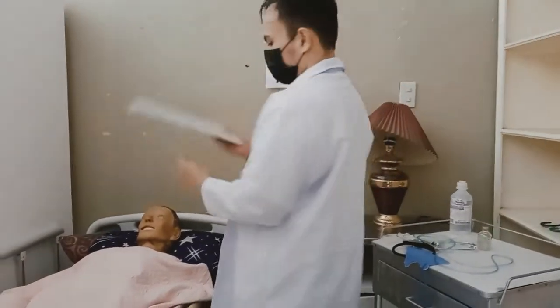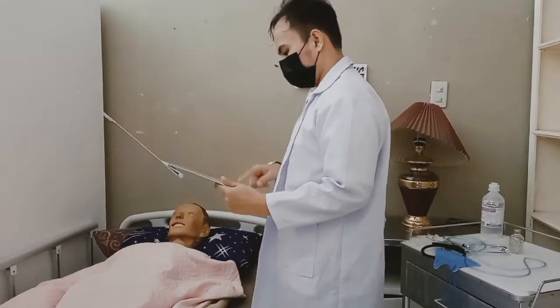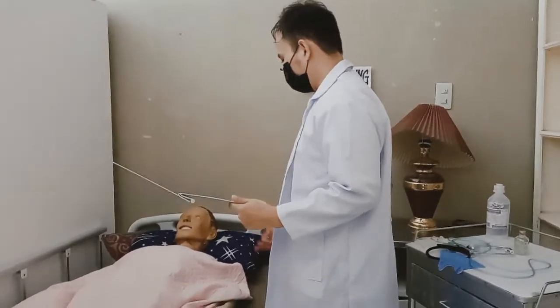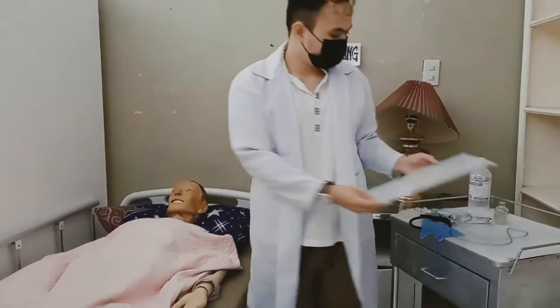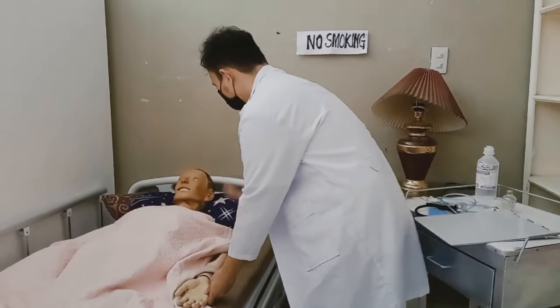Check the name and identification number on the patient identification band. Ask the patient to state his or her name and birth date based on facility policy. If the patient cannot identify themselves, verify the patient's identification with a staff member who knows the patient. Complete the necessary assessment before the administration of medication.